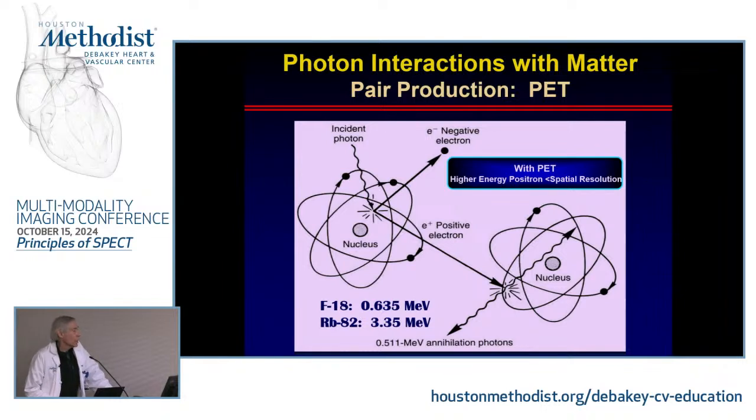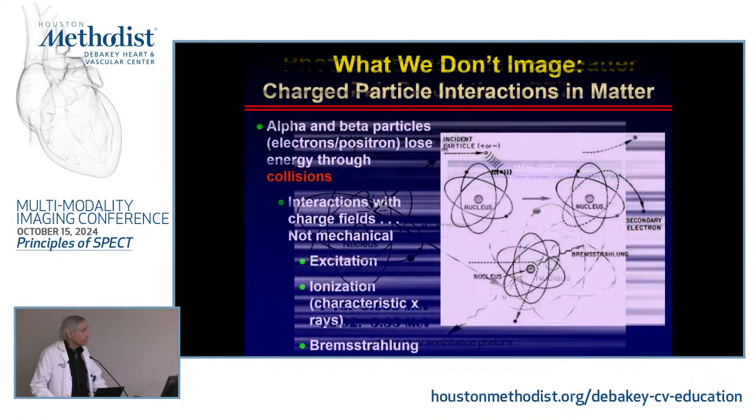And those positron energies can also determine how far they travel through tissue before they annihilate, which means that lower energy PET agents have better spatial resolution than high energy positrons, which can travel further from where they originate before they annihilate.